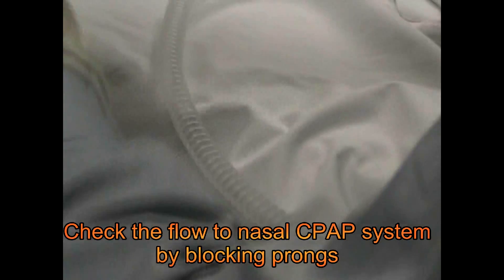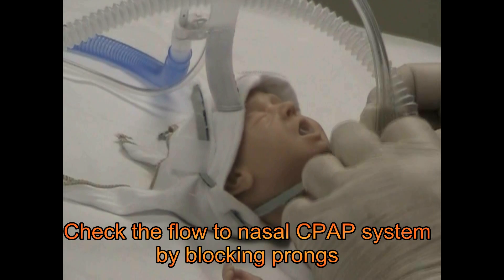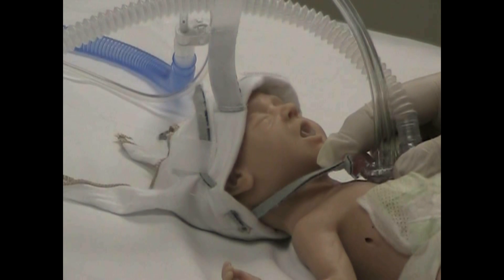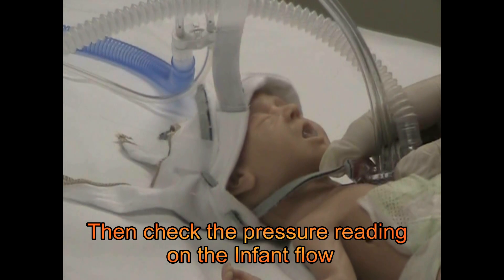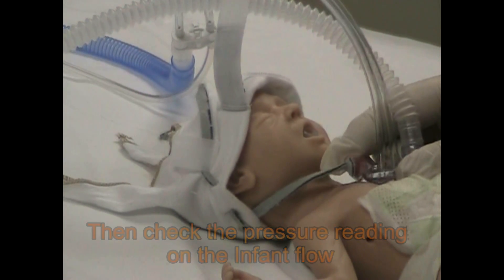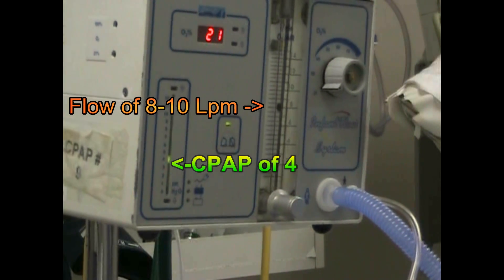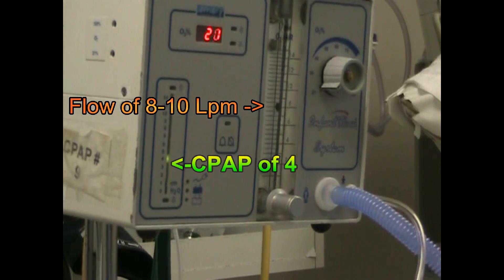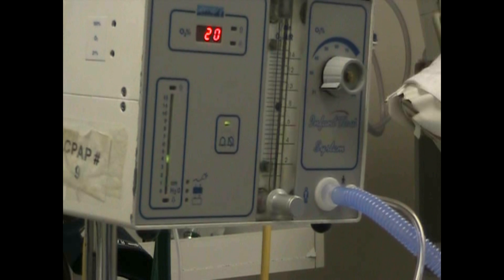Now up here on the baby we want to check if there is sufficient gas flow going through the system. We're going to block off the nares and at the same time check our pressure reading on the InfantFlow. You can see that our flow is at about 8, giving us 4 cmH2O of CPAP — and in this child that's exactly what we want.